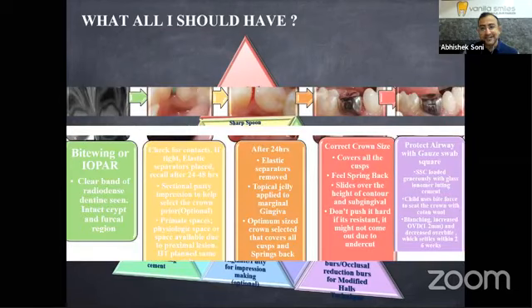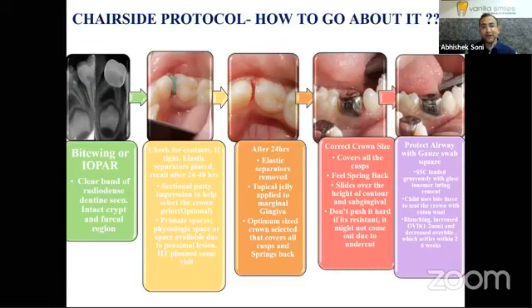So let's look at the clinical protocol. If you see on the figure to the left, there is almost a millimeter of clear band of dentine. You have read that well. You have placed your elastic separators. Try to remove your elastic separators within 24 to 48 hours. Now, because of the elastic separators, there's going to be slight traction. So the child sometimes feels pain, so you may have to inform the parents to introduce analgesics for the child.